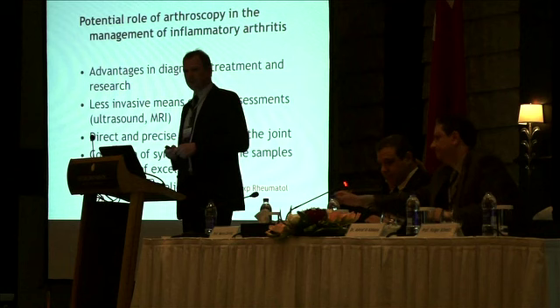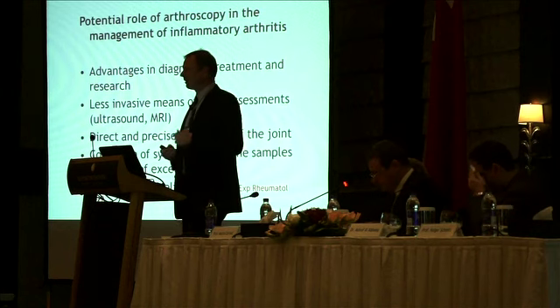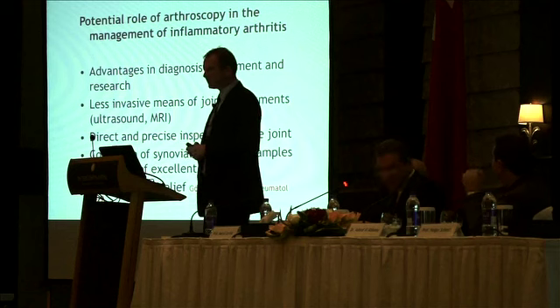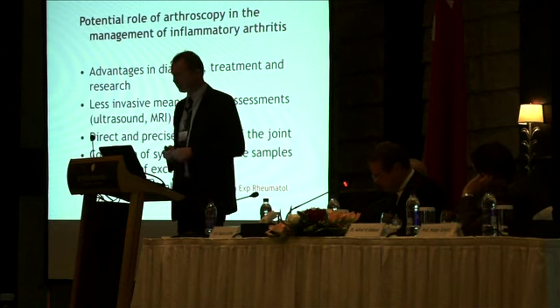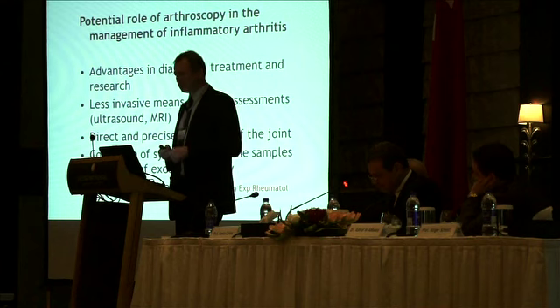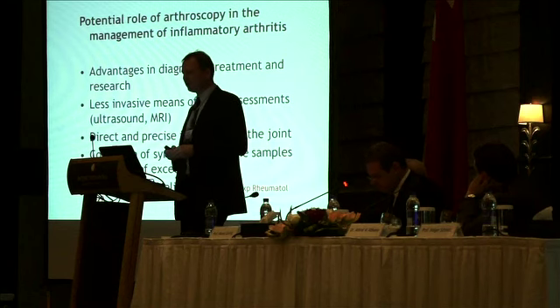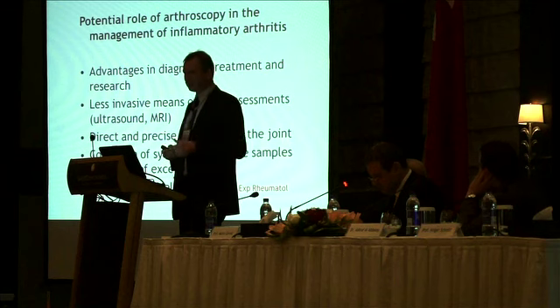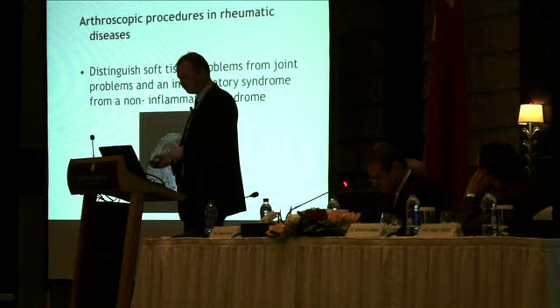We could hear in the morning session that there's a big improvement in the diagnostic tools of joint assessment by ultrasound and MRI, but arthroscopy still plays a very important role in the management of inflammatory arthritis. This is the only way now to have a direct and precise inspection of the joint. And we have the possibility to collect synovial membrane samples as biopsies of excellent quality. And as I will show later in some studies, we can also reduce the pain.